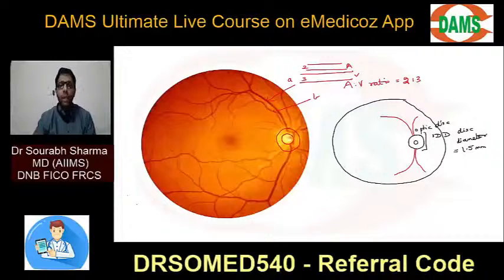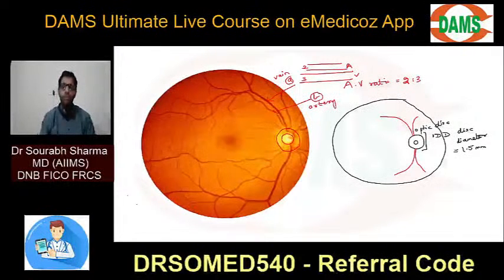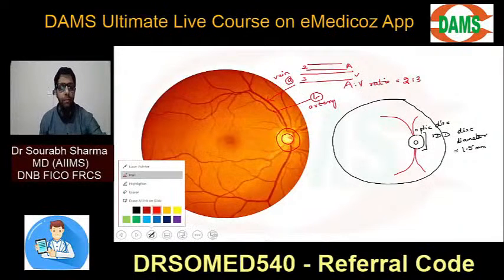So which is the vein here? This A is a vein because it looks thicker, and this B is a retinal artery because its lumen is smaller. So this is the 2:3 AV ratio.